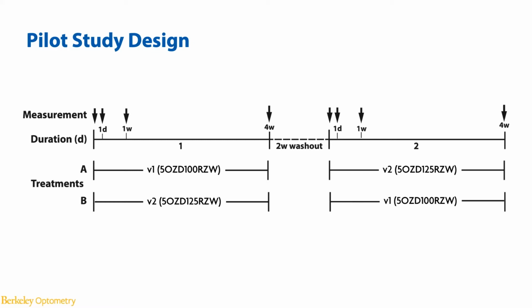The first advantage is that it allows an interocular comparison at the same time, but it also allows the same eye to have basically a direct comparison between the 2 lenses. And this is especially important for any treatment that shows significant individual variability, which I can totally show you. There is a huge and very significant individual variability in any of the ortho-K treatment.